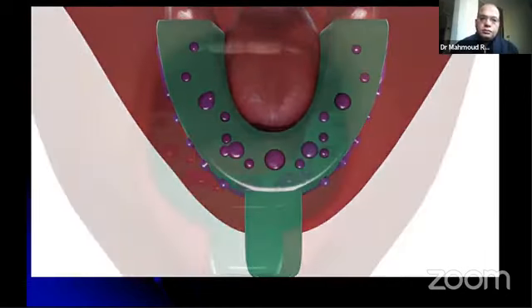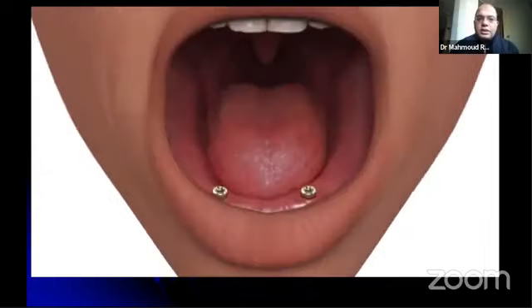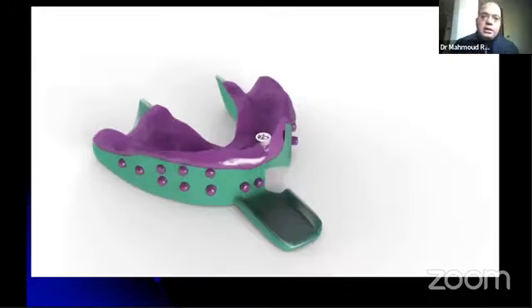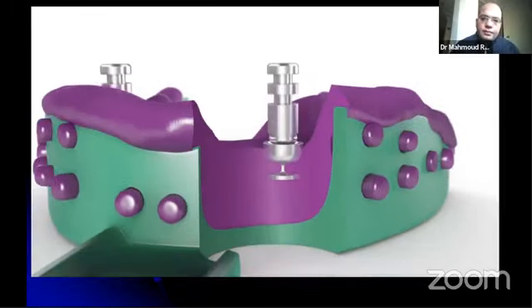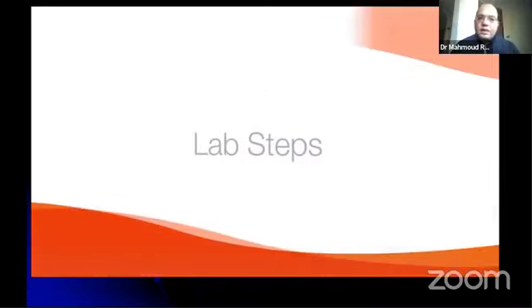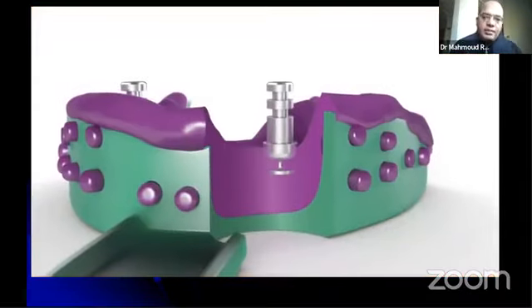Once the impression material has set, remove the tray and the copings will be picked up. Then insert the abutment analog with the implant analog into the transfer coping. Attach the locator analog to the coping in the impression. Send the impression to the lab, in order to pour the cast and make your procedures.